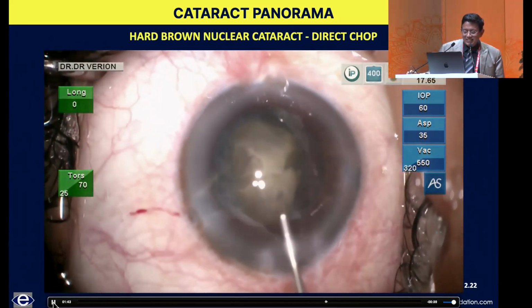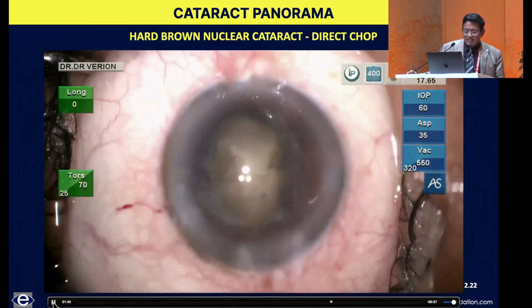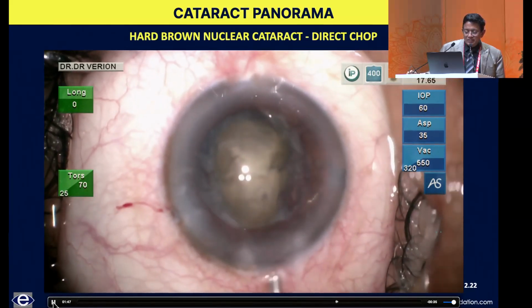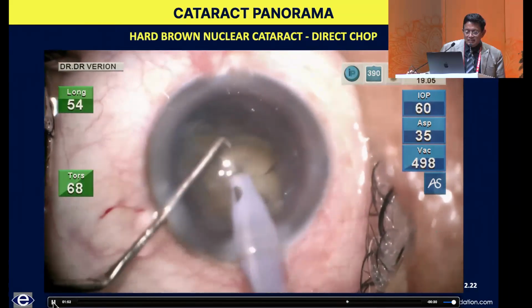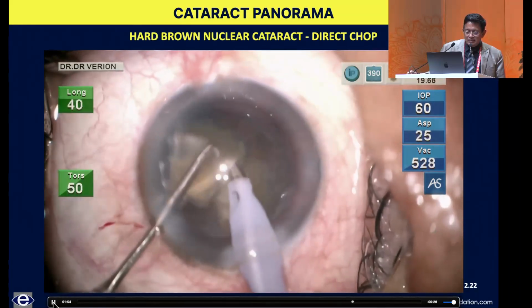But seriously, that is the time, not for the video, but that is the time to go slower, because we tend to relax and floor it, and that's when the pieces fly up and hit the endothelium.